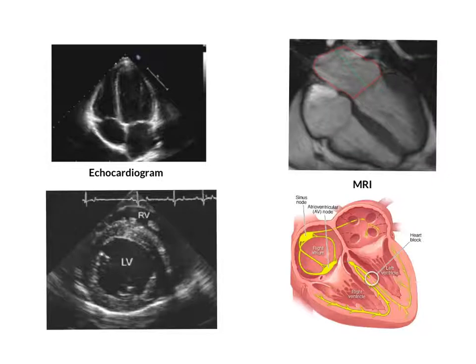So, anyhow, an echocardiogram is sound waves. It works on the same principle of sonar that they used in World War II to look for submarines, and still use sonar now for a lot of other things, even in fishing boats. So what they did was refine it quite a bit and made it so that we could see the heart with a very expensive machine. This is the test that I did, the echocardiogram.